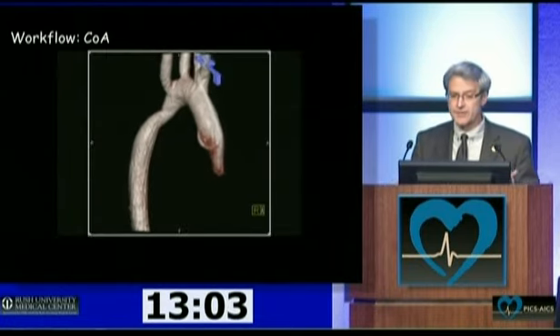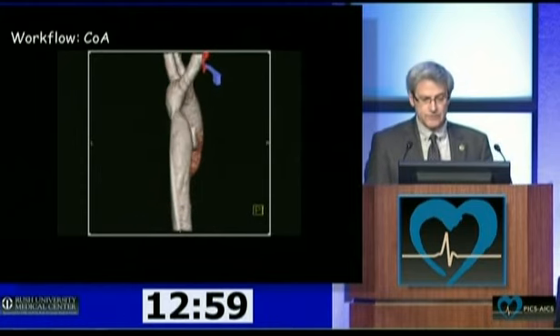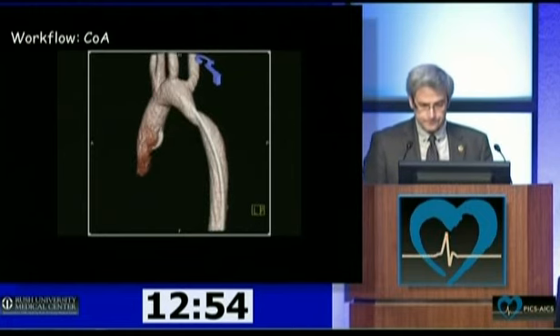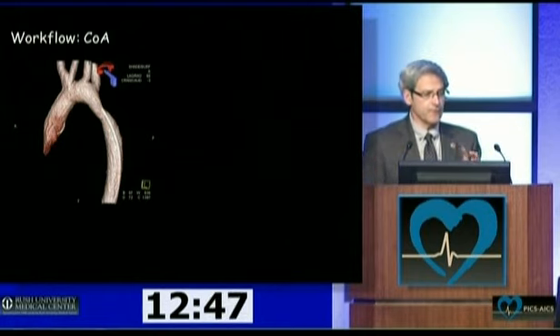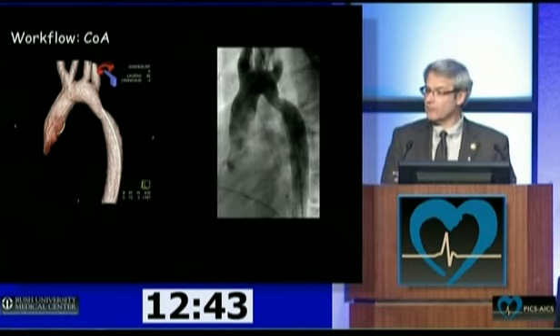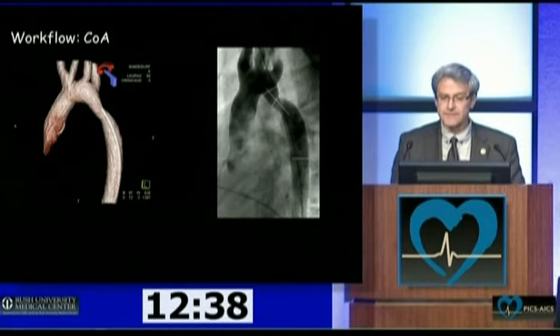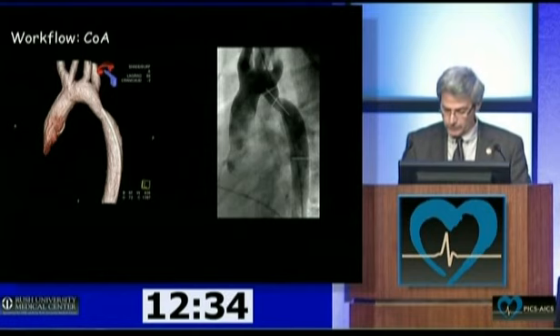This is a typical image, a patient that came in the laboratory for coarctation stenting. We would then identify the ideal projection that we believe would give us the best information for the implantation. We would then do a single plane in this projection in order to make our measurements in systole, so we can pick the stent length and the stent diameter that we would ideally implant.